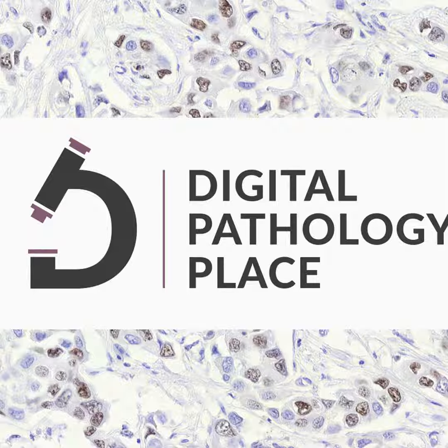Looking for H. pylori. But interestingly, once again, at 20x, for all the rule out H. pylori cases, the difference between the error rate, or the major discrepancy rate, again, DR minus MR, was almost 0 for those cases. So even at 20x, there was no signal that looking for H. pylori in gastric biopsies was more of a problem with 20x versus 40x.